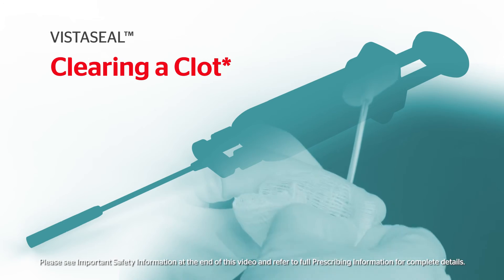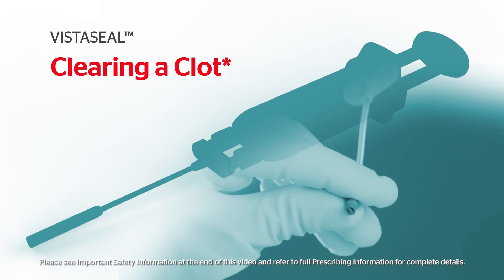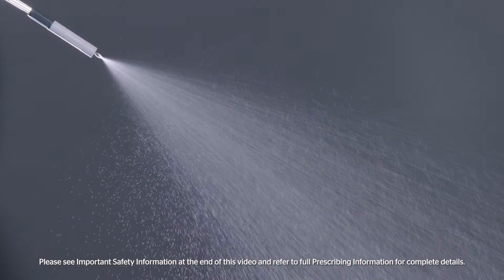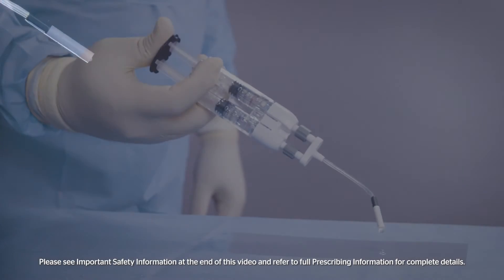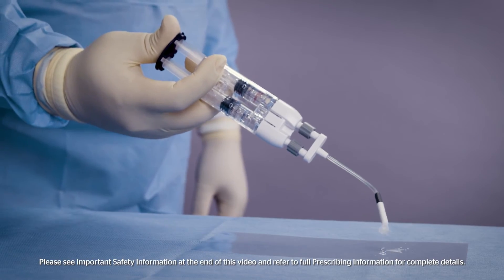VistaSeal is designed to deliver a rapid, adherent and durable clot. Once spraying has stopped, a clot will form in the airless spray tip. Do not try to push hard to clear the clot.